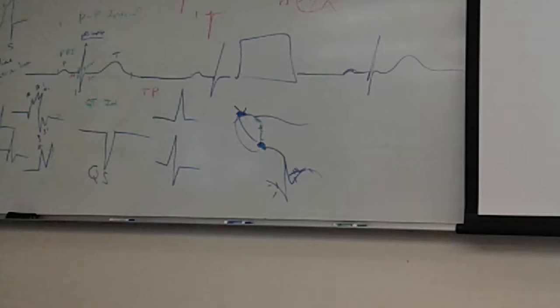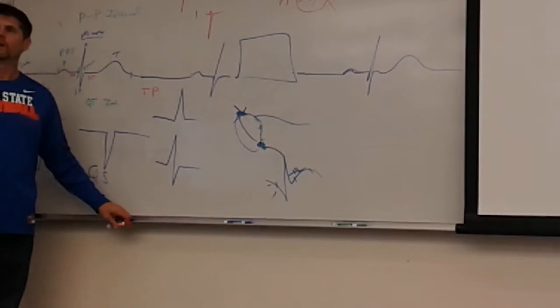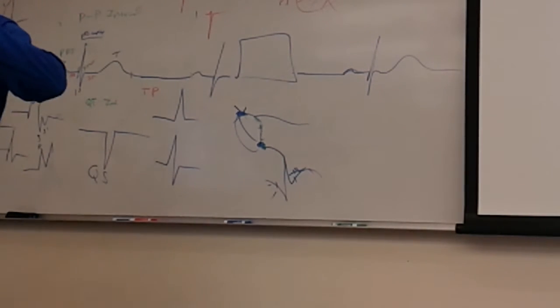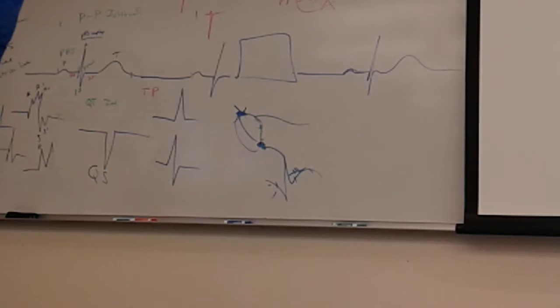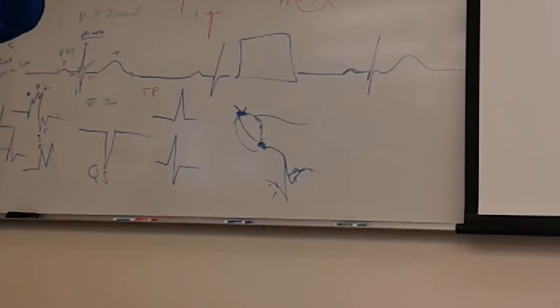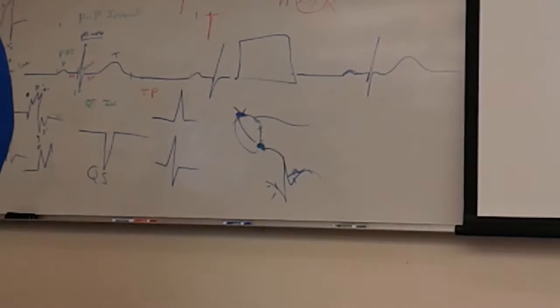What defines tall or small, like certain millimeters? Excellent question. I don't have an answer for you. It's somewhat subjective, and it's in comparison within that person's own set of QRS complexes that we see throughout all of the leads we're looking at. So kind of eyeballing it? We do, to a certain degree. That's correct.